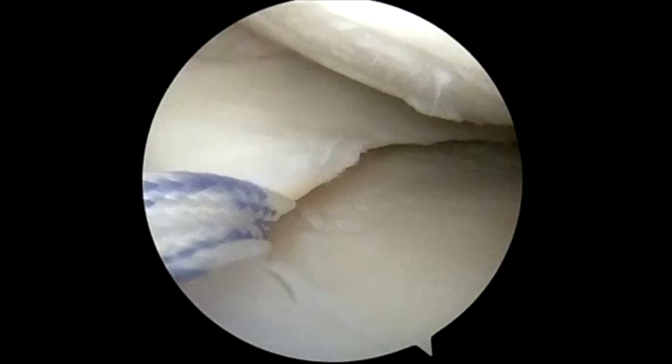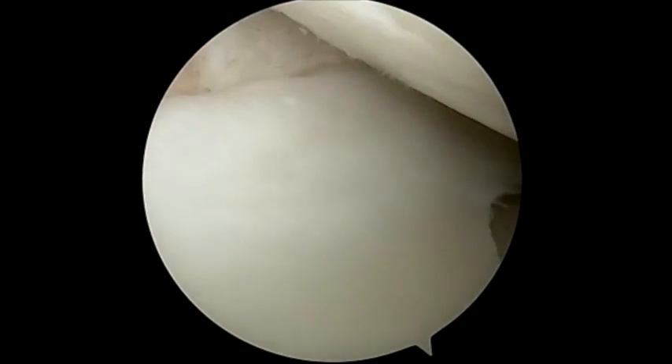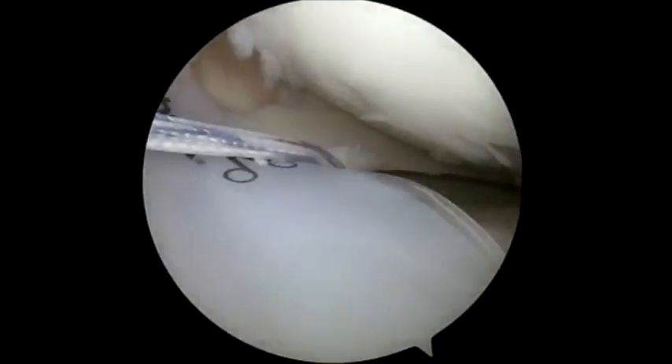We use a suture lasso to pass a horizontal suture tape through the capsule of the meniscus at the posterior medial aspect of the meniscus.